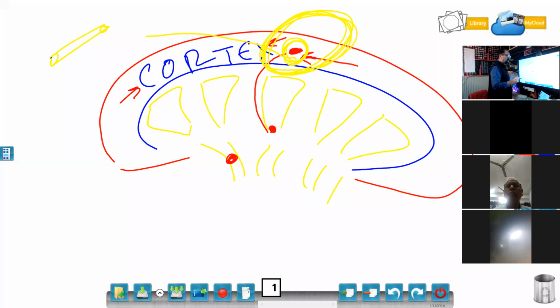But you might be thinking, why is a vessel not looking like a vessel? Because maybe you are cutting this vessel transversely, in cross section. And if you are cutting it in cross section, it will look like a small calculus. Now see how important this anatomy is. If you know that this is cortex and you are seeing a dot-like structure, a hyperechoic circular or oval, this can be a small calculus, or a cross-cut vessel, or even a calcification.